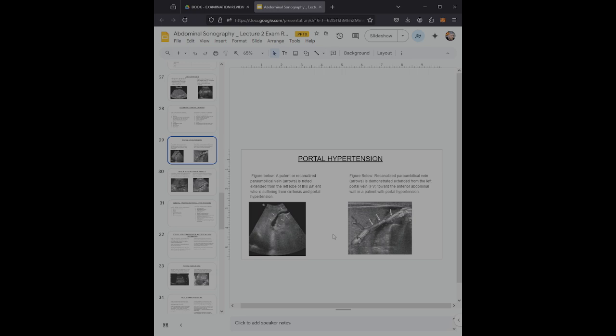These are all collaterals. And one of the most identifiable in this case is the recanalization of the paraumbilical vein, and we term this a patent paraumbilical vein, and it is associated with the left portal vein, the ligamentum teres, and the falciform ligament, and this becomes open again, as it once was in utero, and shunts blood away from the liver into the inferior epigastric veins, or in this case the superior epigastric veins, and at this point we call it the Cruveilhier-Baumgarten syndrome.